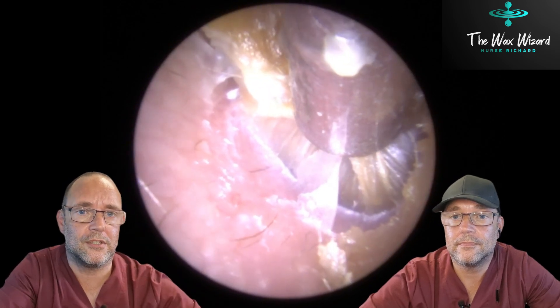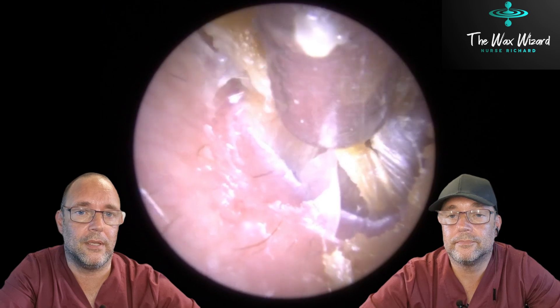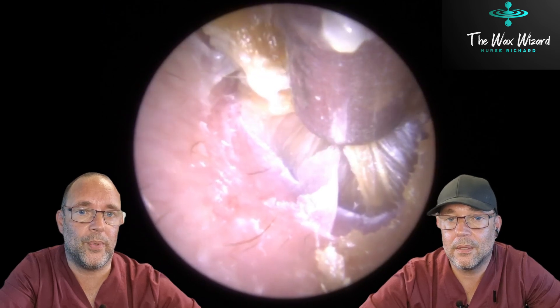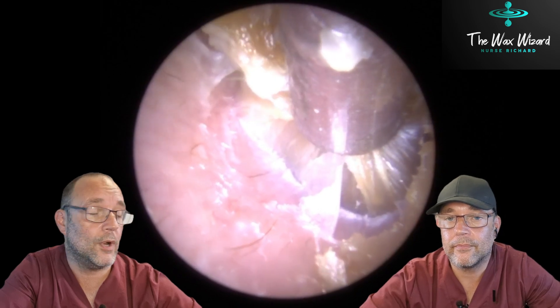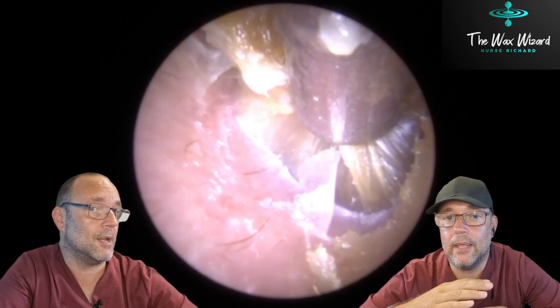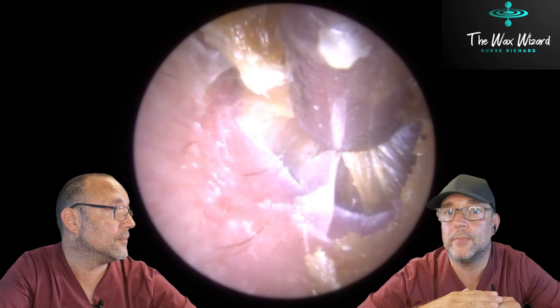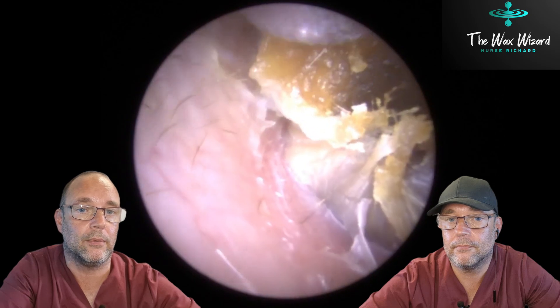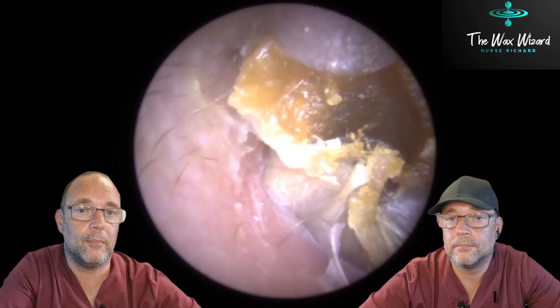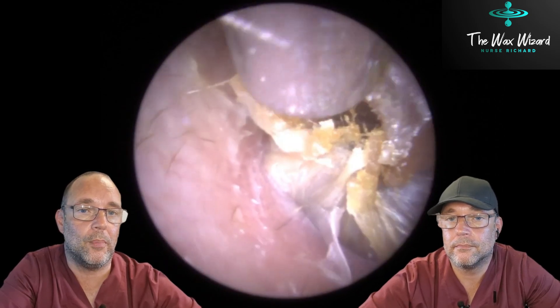And it's difficult, this. As you can see, there's quite a lot of dry skin surrounding it, which is squeaking a little bit. Now, I've got a good seal of it there and I'm holding onto it. Why do we hold onto it for quite a long time and not move, Bob? It allows the pressure to build up in the machine to pull it out — the suction tube builds up power so you can pull it out. That's right. Not getting anywhere with that bit, so let's go for the top bit there.